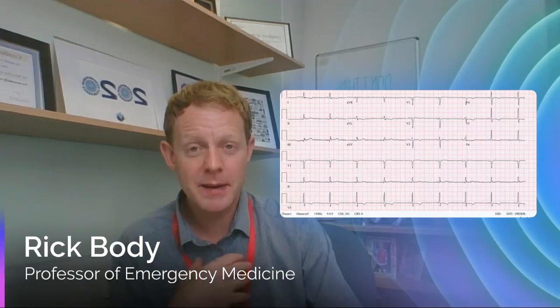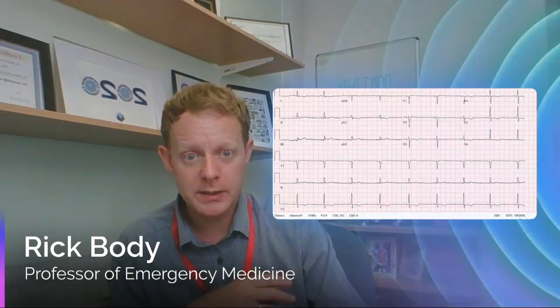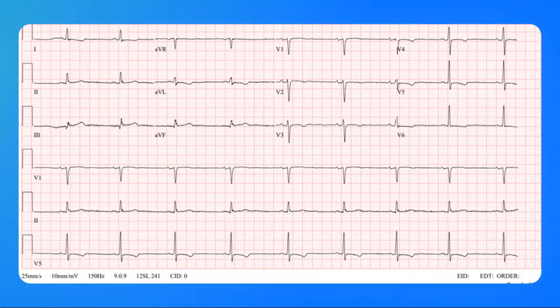This is one of the most commonly missed abnormalities in my experience. And here we've got a case of a subtle inferior STEMI. So obvious abnormalities that you might see on this ECG are the T-inversion through the precordial leads — everyone seems to spot that, it seems obvious — but there's also an inferior STEMI.